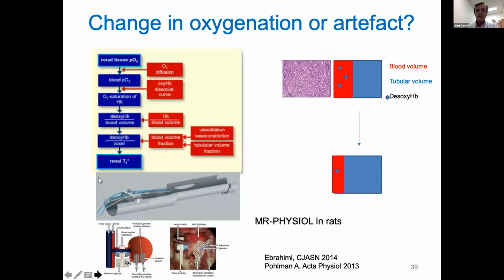We seem to be blocked, but what they showed is that injecting ferumoxytol is an elegant way to have an idea of the amount of relative blood volume in the kidney at each time point. As ferumoxytol really stays in the renal circulation, it is not filtered, and the more ferumoxytol arrives in your kidney, the larger will be the change in R2 star, because ferumoxytol is full of iron, will acutely change your R2 star signal and will lead, so the bigger the change, the larger the blood volume fraction.